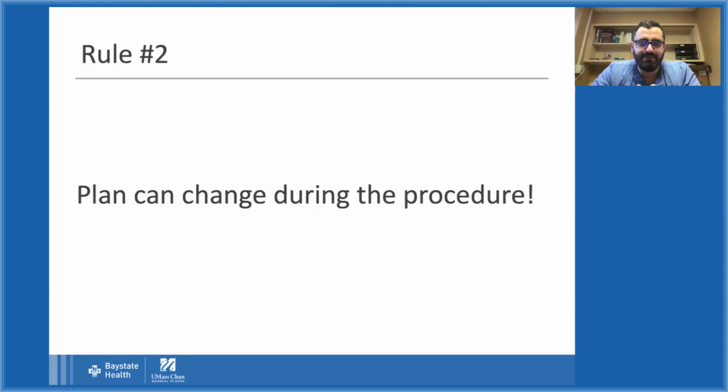Rule number 2, plan can change during the procedure. Many times I would discuss the plan with the patient in the clinic, and the patient decides, well, let's go with ESD. I will plan for ESD. I go to the procedure, and something happens.